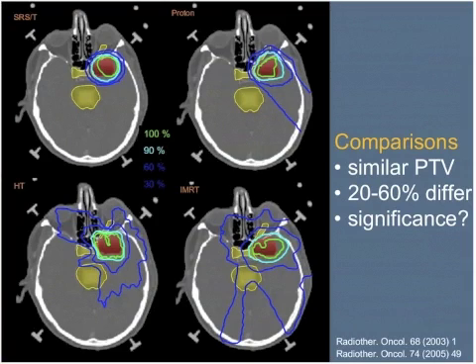In terms of comparing photon beam techniques and protons and such, when you do head-to-head comparisons, really what you could find is that all of these platforms give you good conformality to the target. There are some differences in the low dose region, but it's really hard to know whether that is clinically significant, and depends who you're talking to and what tool they have as to how strongly they feel that difference is important or not.